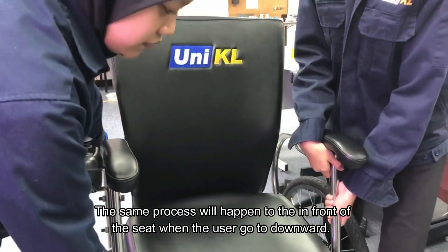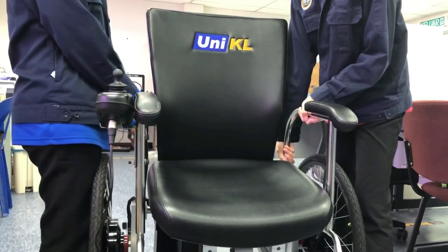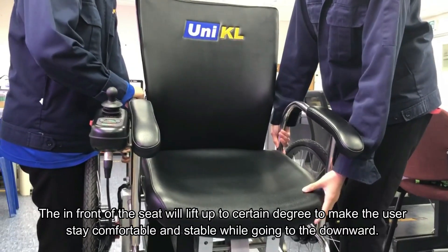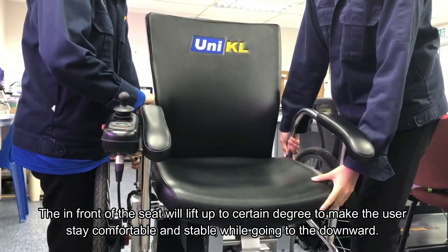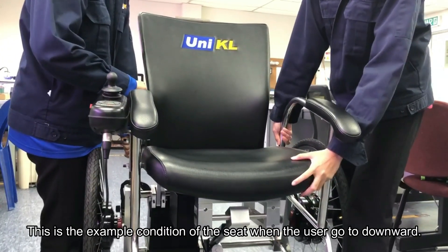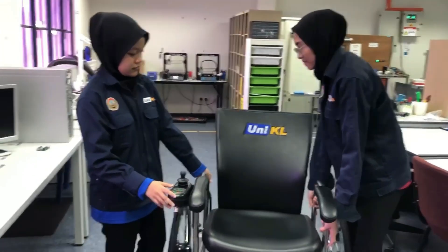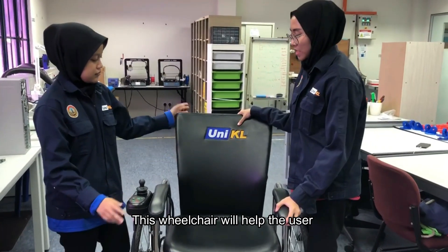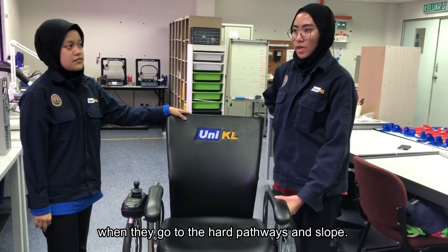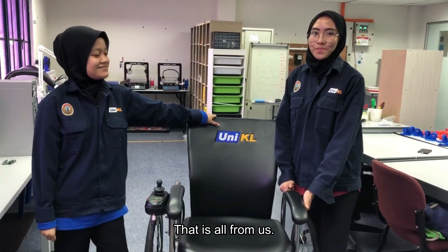The same process will happen to the front of the seat when the user goes downwards. This wheelchair will help the user stay comfortable and stable when going downwards. This wheelchair will help the user feel less back pain when going through hard pathways and slopes. That's all from me.